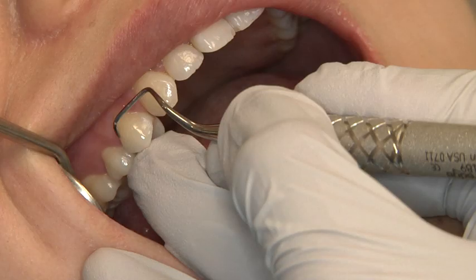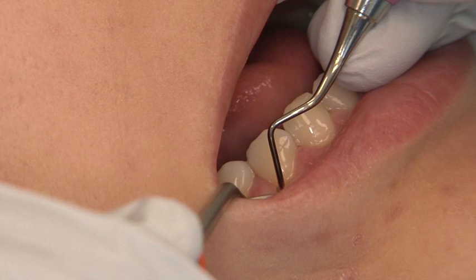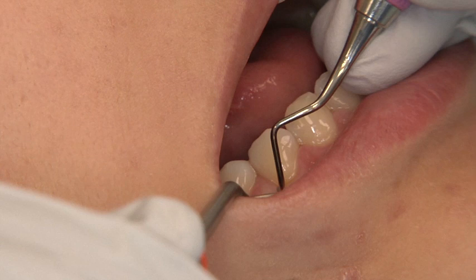Incorrect positioning will not result in parallelism of the terminal shank in relation to the long axis of the tooth, and the functional shank will appear down and around the tooth. Insert the blade beneath the gingival margin at 0 degrees by lowering the handle slightly and holding the face of the curette against the tooth surface while gently inserting the blade beneath the gingival margin.